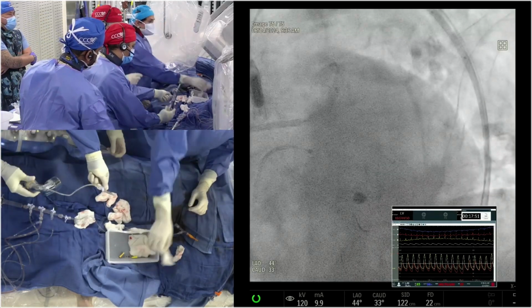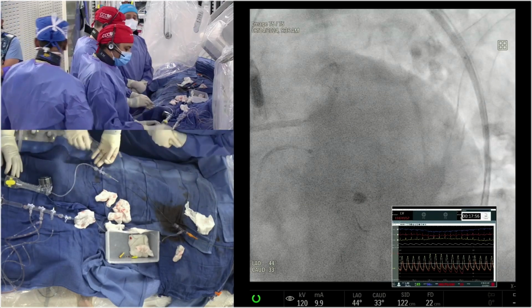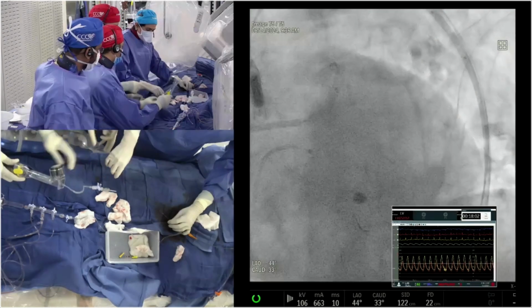Okay, so what I'm going to do is go with the left main, it was about 5.0, right? Yeah, I think that's right. So I'm going to do a POT of the left main, recross, and a kiss, and we'll show you the final IVUS results.